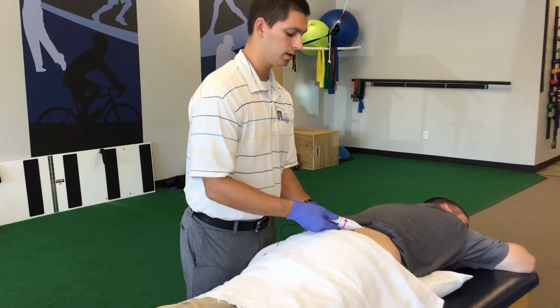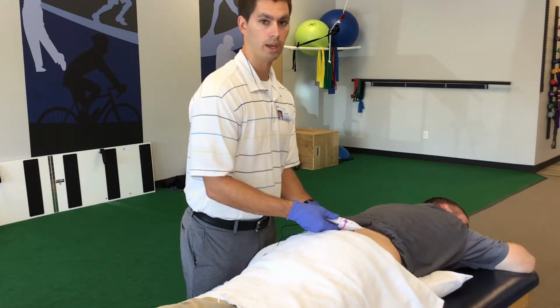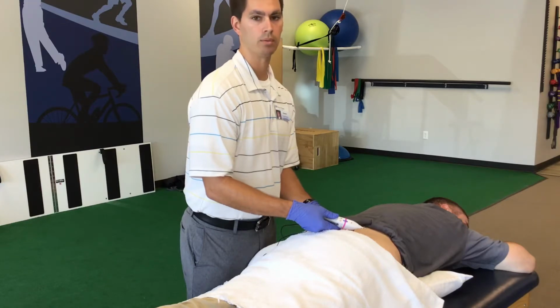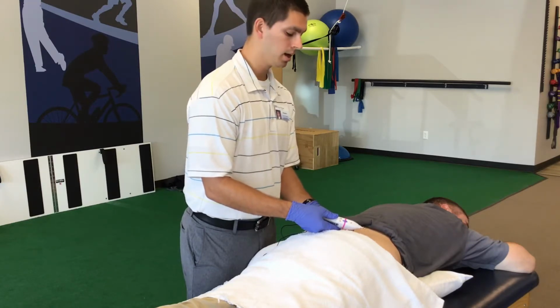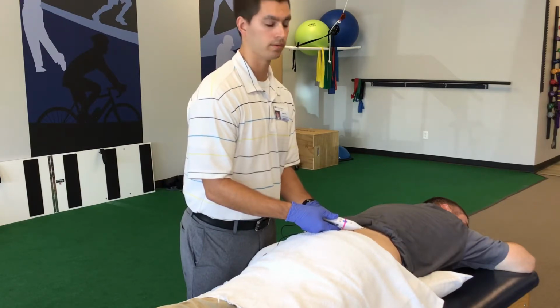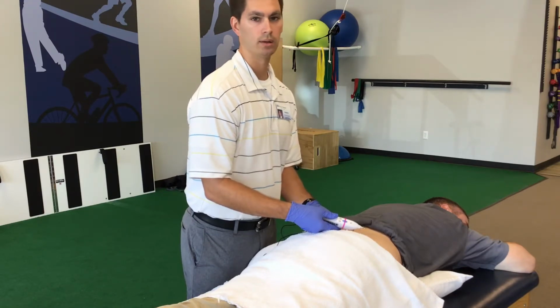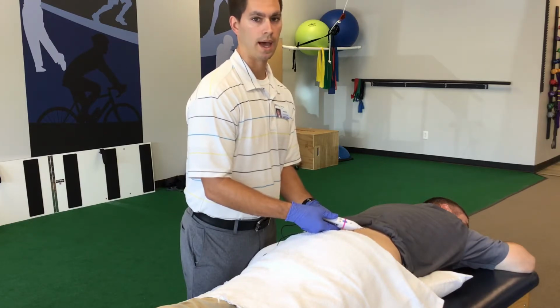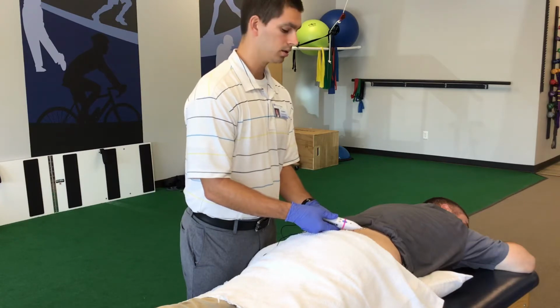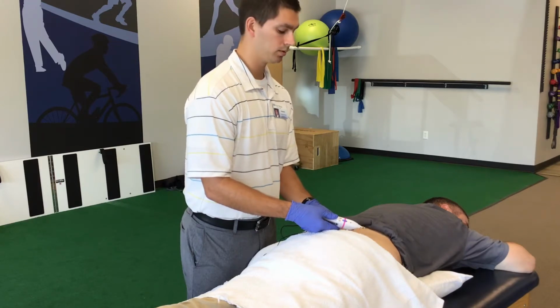And so I'll just kind of talk to you here. Dry needling, as we've talked about in previous episodes, is a tool for really any muscle condition. It's not going to correct anything as far as a broken bone or a torn meniscus or anything like that. But it is pretty effective for musculoskeletal pain if it's originating in the muscle itself. What this is doing is we go through, we poke the muscle, and it releases some of its cell contents that are causing it to spasm or causing it to have increased tone out into the space surrounding the cell. What that does is it helps promote relaxation. It can help facilitate healing. Typically, we see a reduction in pain.